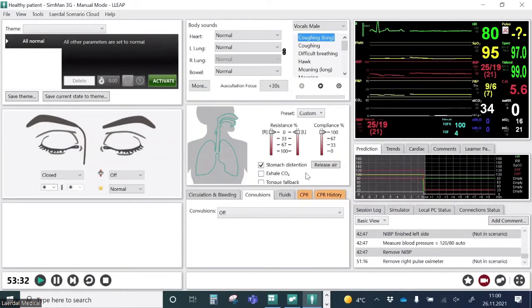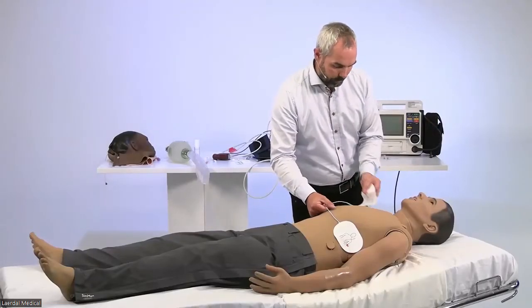And it's nice to have the ability to use a real clinical system. There's also a possibility to downgrade to the standard skin if you prefer to use training equipment to do defibrillation scenarios. So both options are possible. Okay, I'm going to remove this.